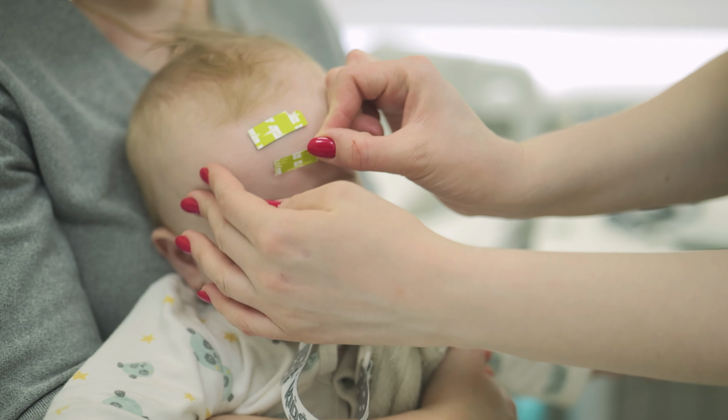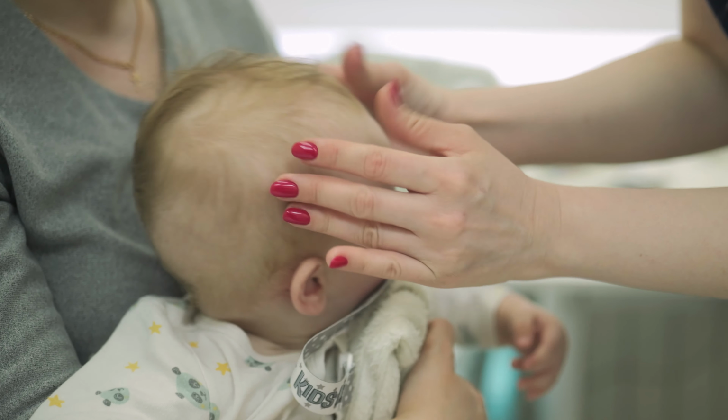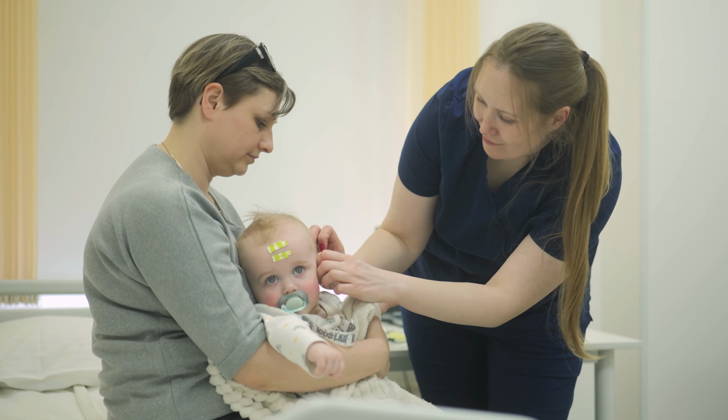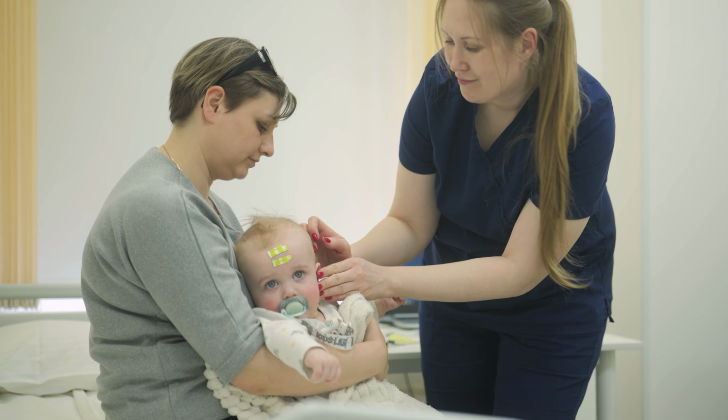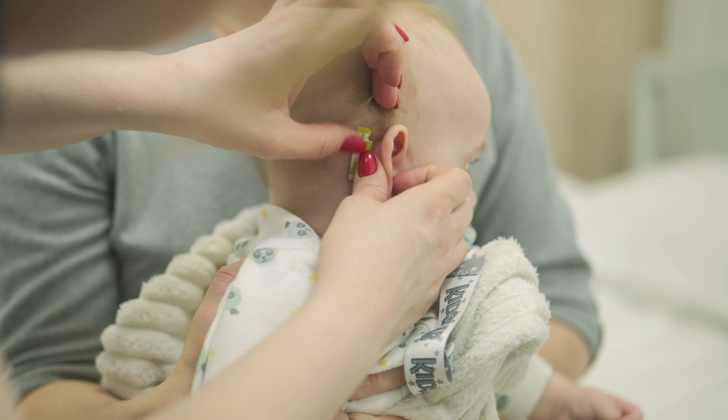The electrodes are placed on the mastoid and forehead. The upper electrode is placed on the border of the scalp and forehead. The lower electrode is placed closer to the bridge of the nose. It is important that there is a distance between the electrodes so that they do not touch each other.